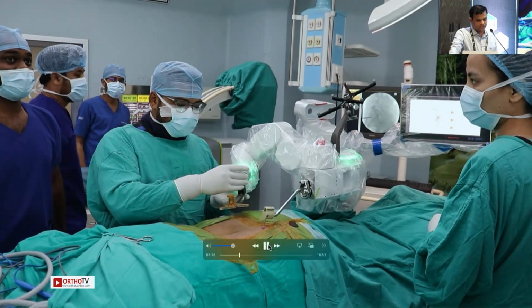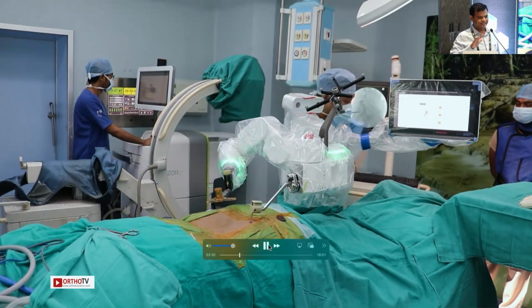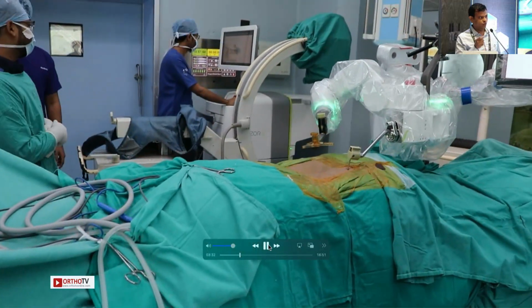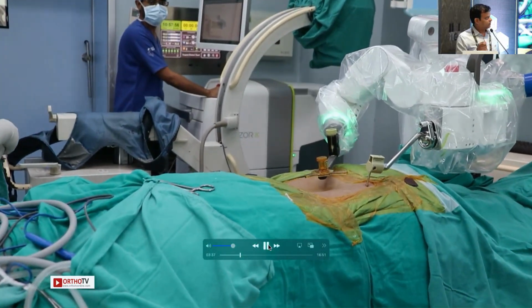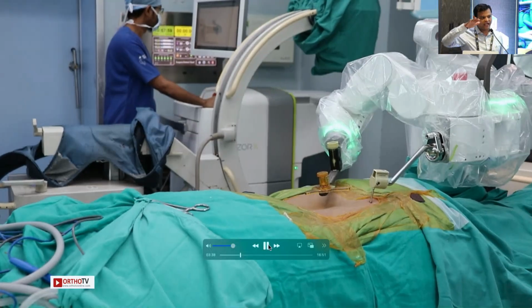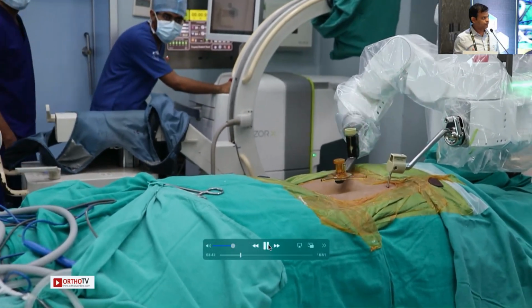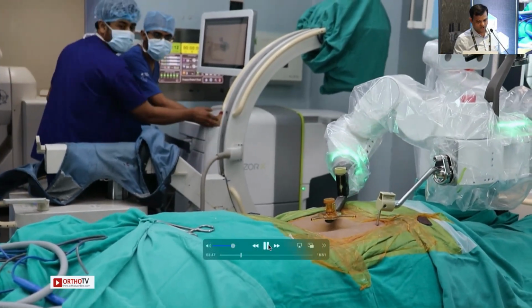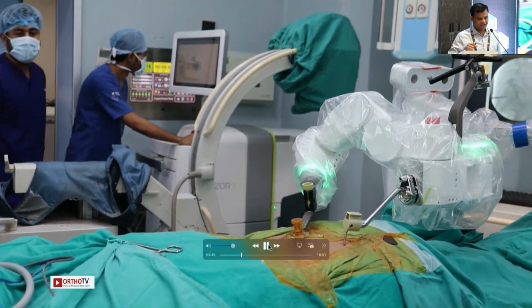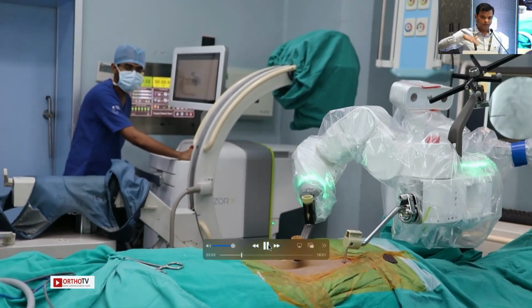This tracker goes and sits in the same coplanar way where you had already told the robot by using your chicken leg. And it has to be as close as possible to the patient, otherwise your errors can increase. The closer to the patient, the better the accuracy. And you see that it's going into that coplanar way where your vertebral bodies are positioned.